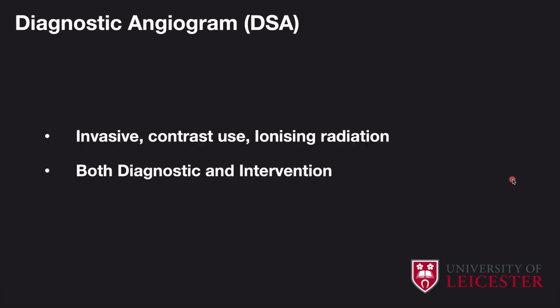So even though angiogram is invasive, uses contrast and radiation, it is traditionally considered to be the gold standard for vascular imaging. Its strength nowadays lies with its intervention ability. A lot of emergency and elective cases can be successfully treated with endovascular technique.